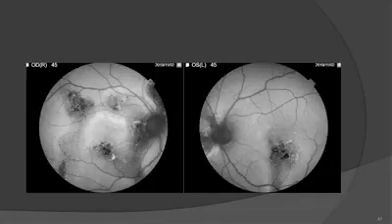So before I go to any invasive imaging modality, I did the fundus autofluorescence. And surprisingly, when I did the fundus autofluorescence, I could find very nicely gravitational tracts in both the right eye and the left eye, one of the typical findings of chronic central serous retinopathy.